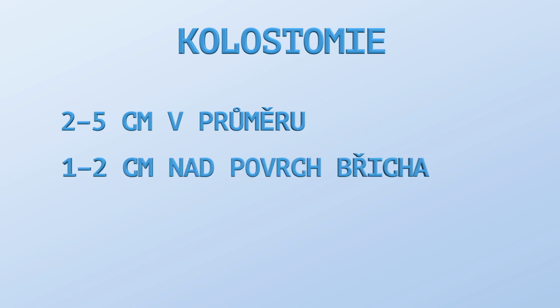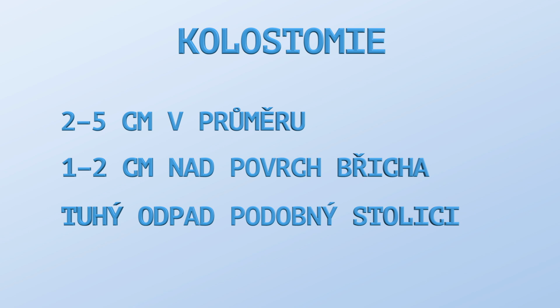The externalized large intestine typically measures between 2 and 5 centimeters in diameter and protrudes 1 to 2 centimeters above the abdominal surface. Colostomy expels solid waste resembling stool and is usually emptied once or twice a day depending on diet.